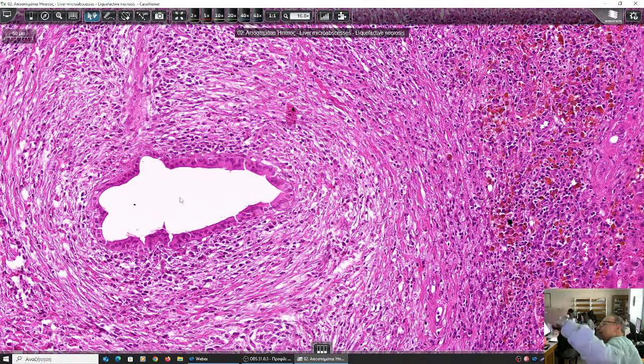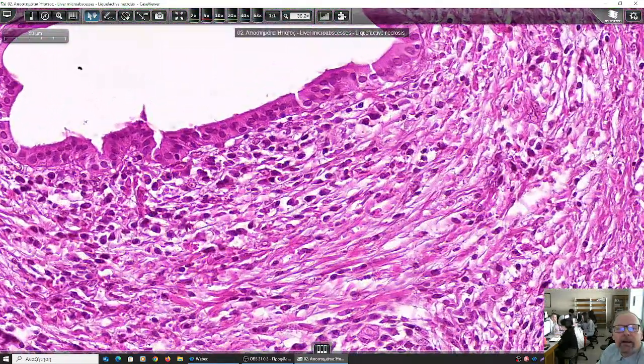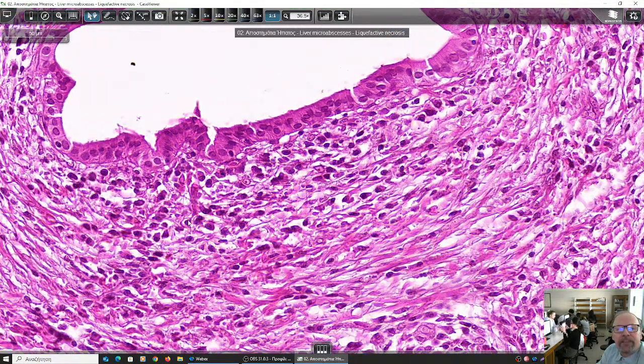Yes. So if we had many cells there, we could presume that it was an ascending cholangitis. However, in this specific bile duct, there are some inflammatory cells here. Can you identify them based on the nuclei? Which inflammatory cells are these here? You'll have to look at the shape of the nucleus. If the shape of the nucleus is round, you say mononuclear, mainly lymphocytes. If it is lobulated, you'll say either neutrophils or eosinophils. Eosinophils are red. Their cytoplasm is red.